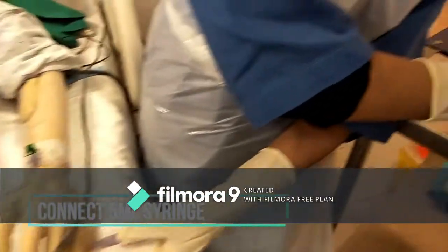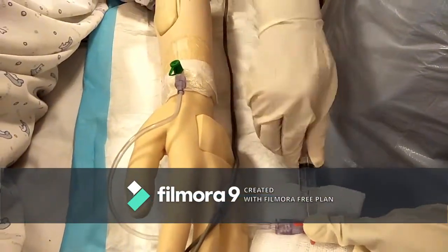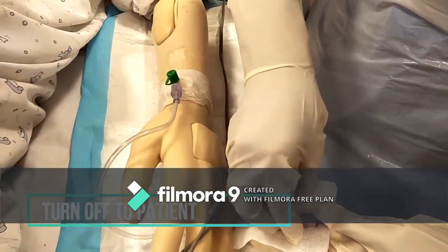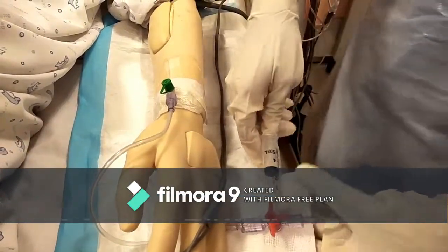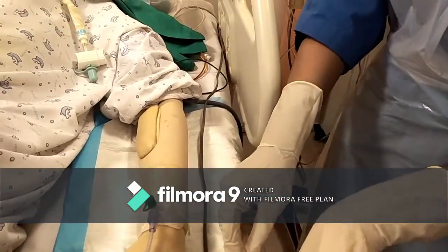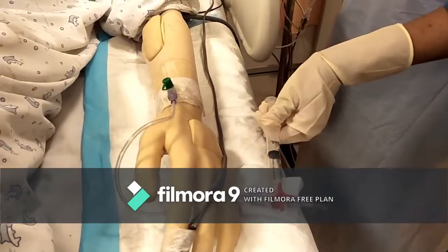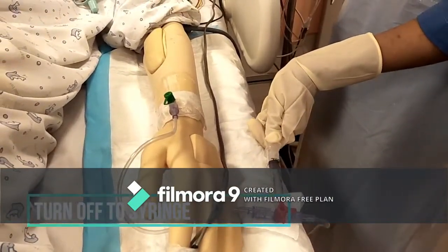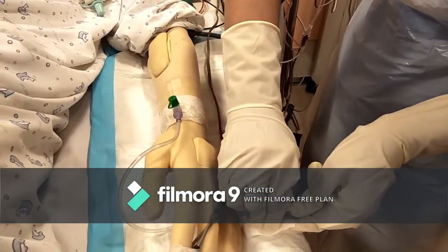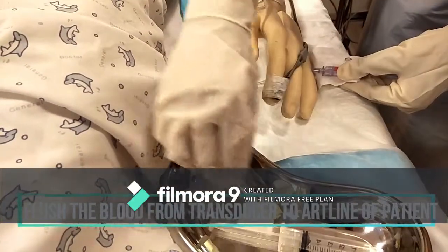Next, connect a 5 ml syringe to flush. Turn on the stopcock. Then flush the tubing from the transducer. Next, put on the stopper. Flush the blood from the transducer to the arterial line of the patient.